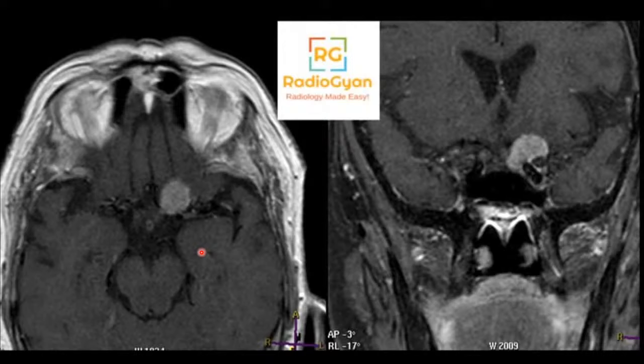So yeah, both images are post contrast images. Okay, what are the typical signs described for a meningioma? Although we don't see it here, right? So Ayush, Ronit, all of you have rightly pointed out.